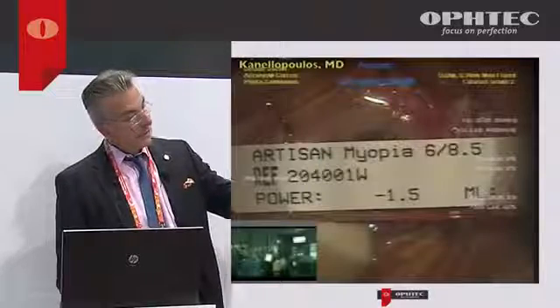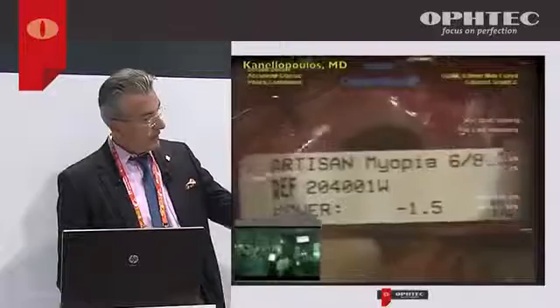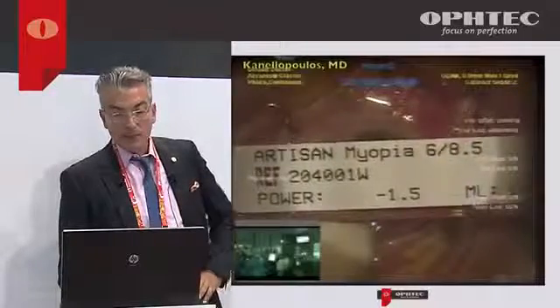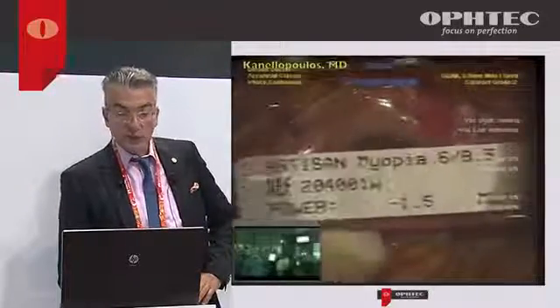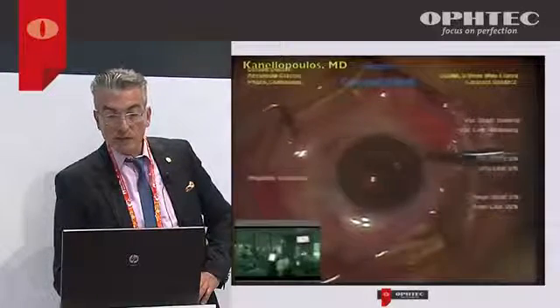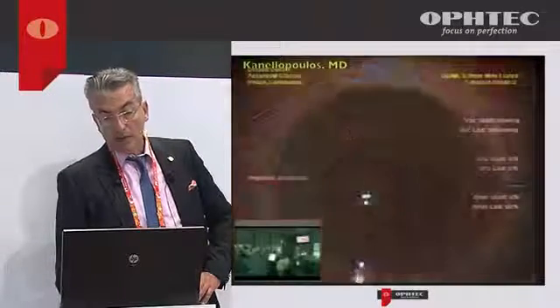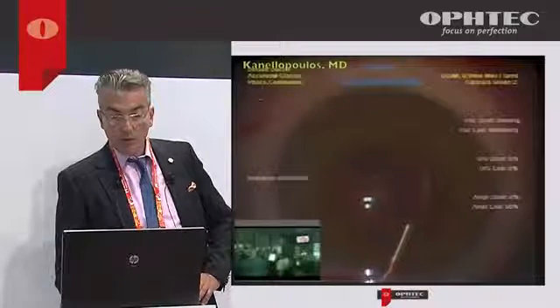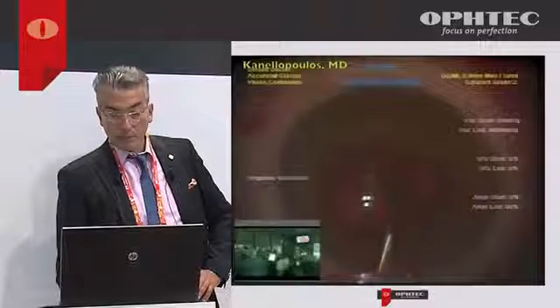And since the lens has a slight curve, we flip the lens upside down so the curve does not rub on the iris. So the lens is basically hanging upside down of what we would use if we were placing it in the anterior chamber. So you can see the maneuver here. This is the lens as it is normally placed, and we will turn the lens.